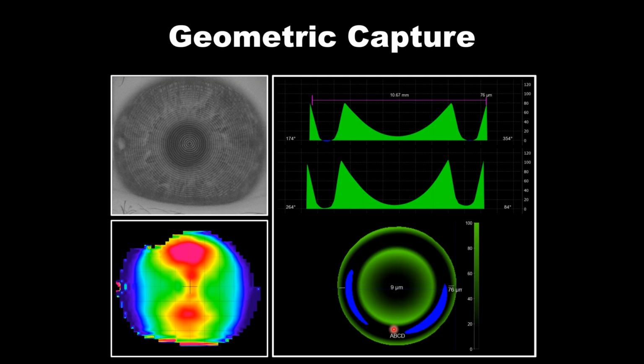Now, all of these concepts that we've talked about have really been related to ortho-K lenses, but this is true of any corneal GP that we might design a lens for. We want good quality topography for all of our rigid contact lenses, not just the ortho-Ks.